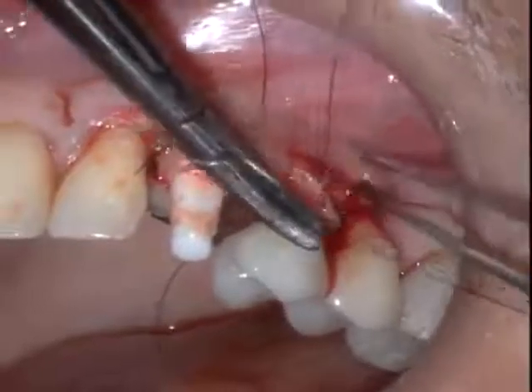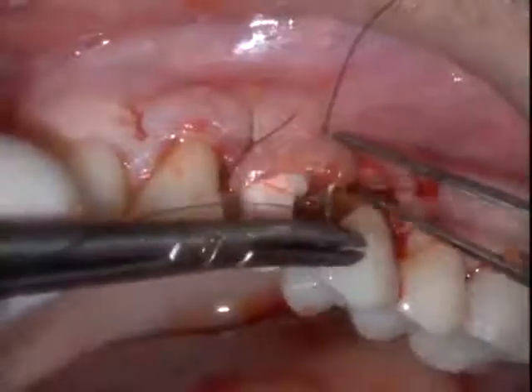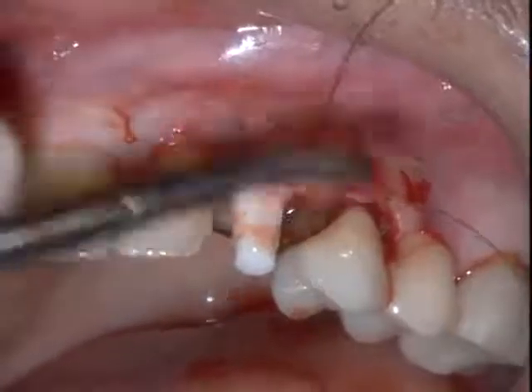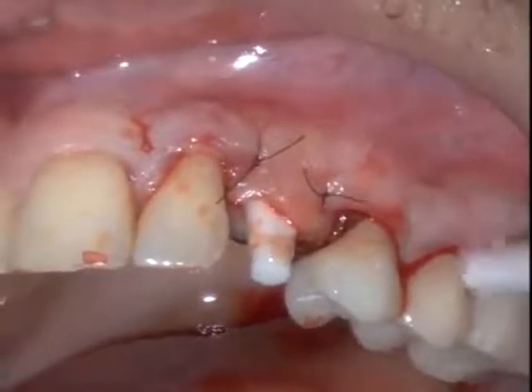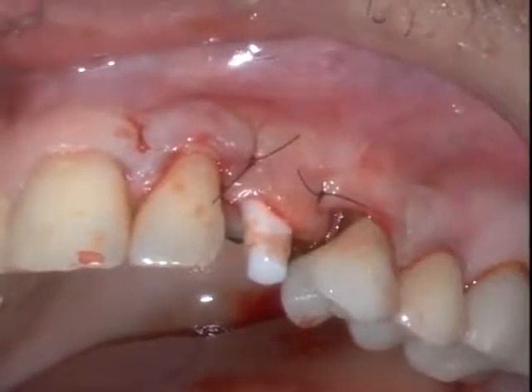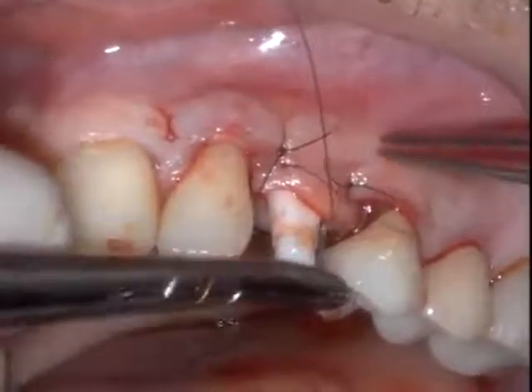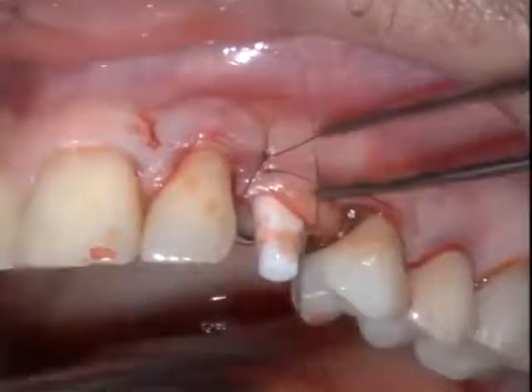We're going to utilize, in this case, a sling mattress vertical suture, which utilizes the lingual of the bicuspid to sling the suture around and give ourselves the ability to press that tissue up against the facial aspect of the implant site. So we have now, with two vertical mattress sutures, been able to secure the graft in its proper position.